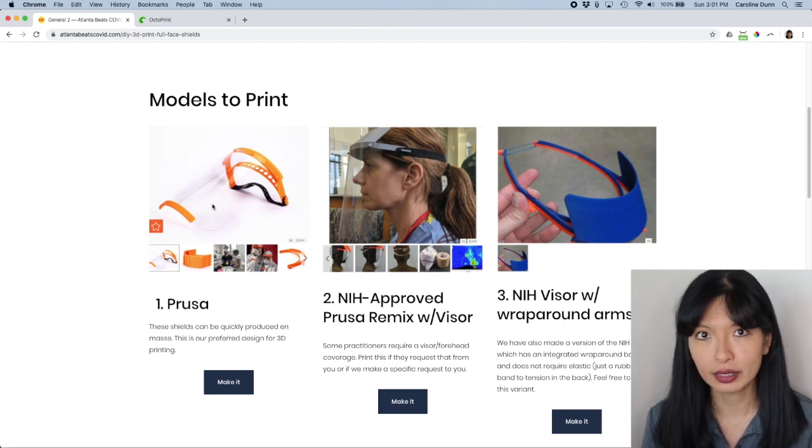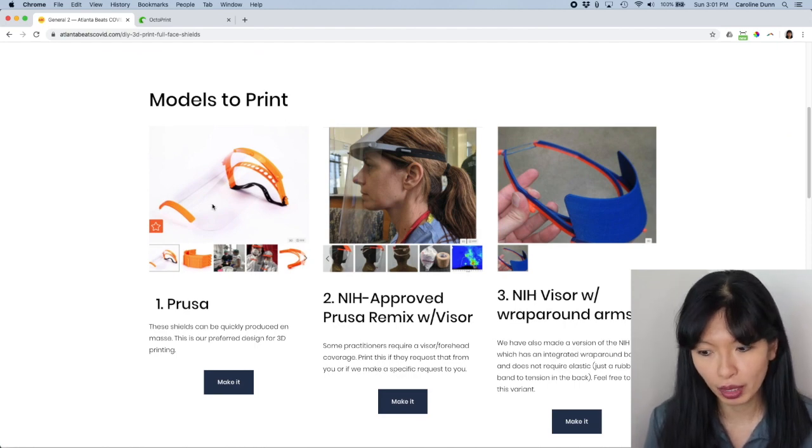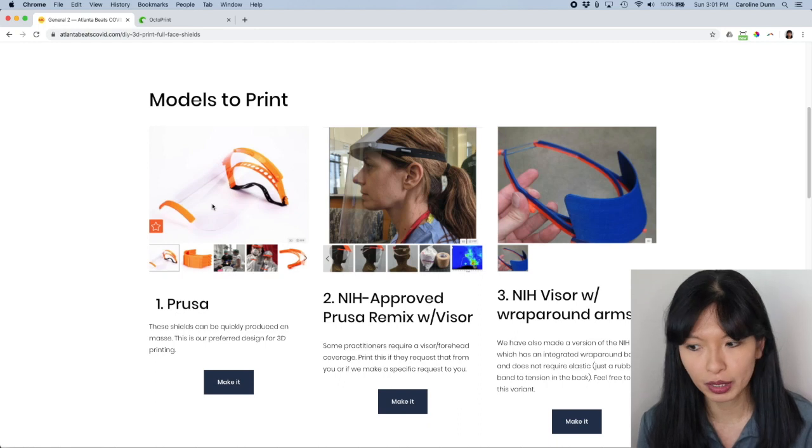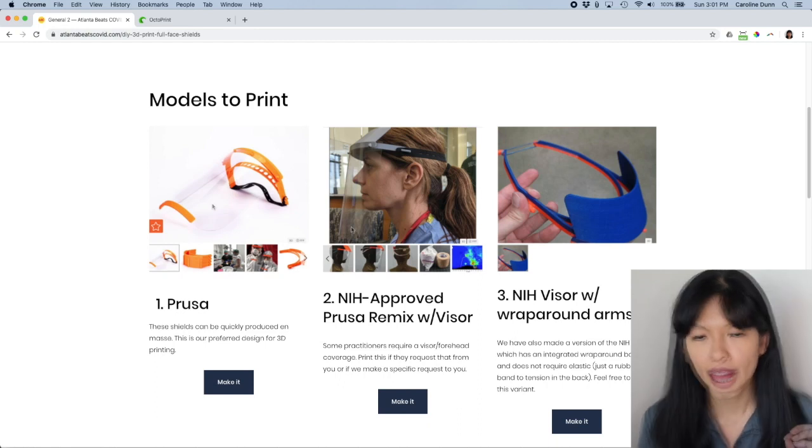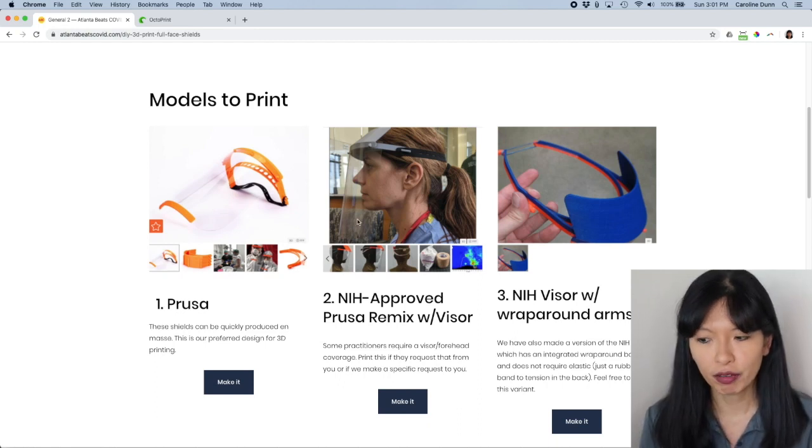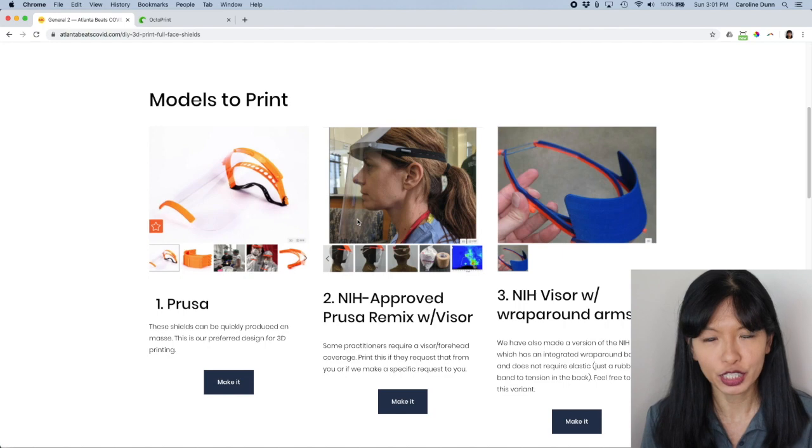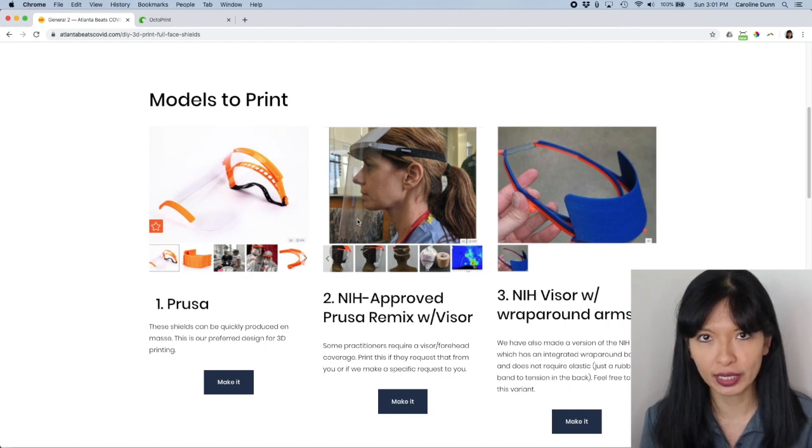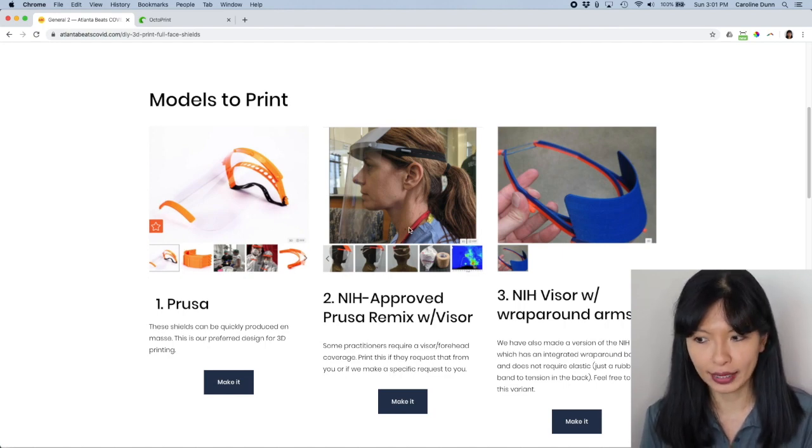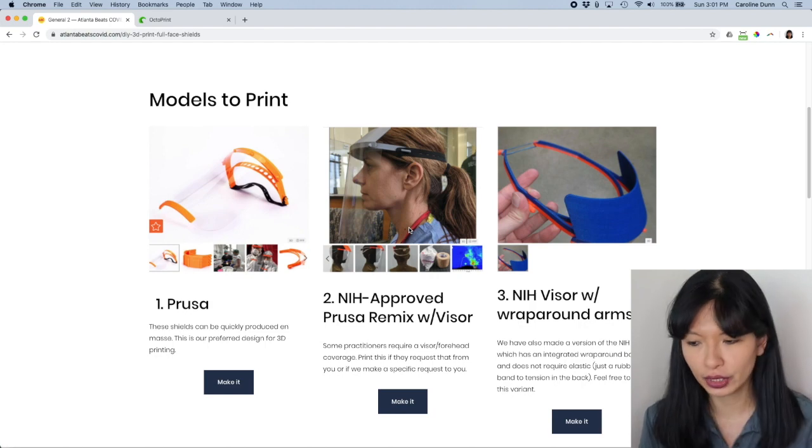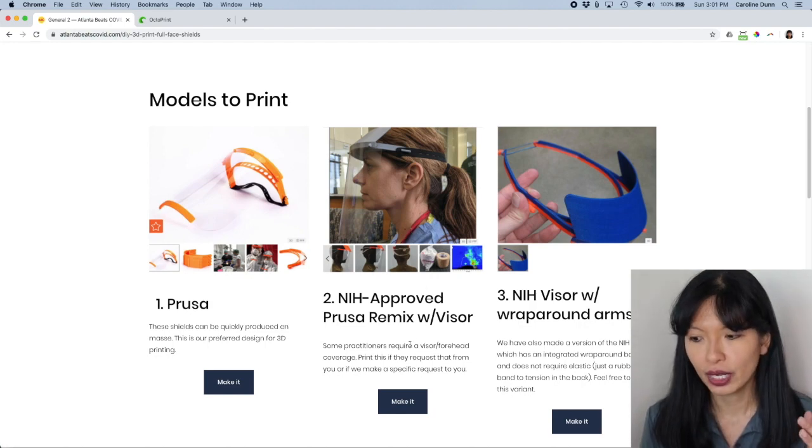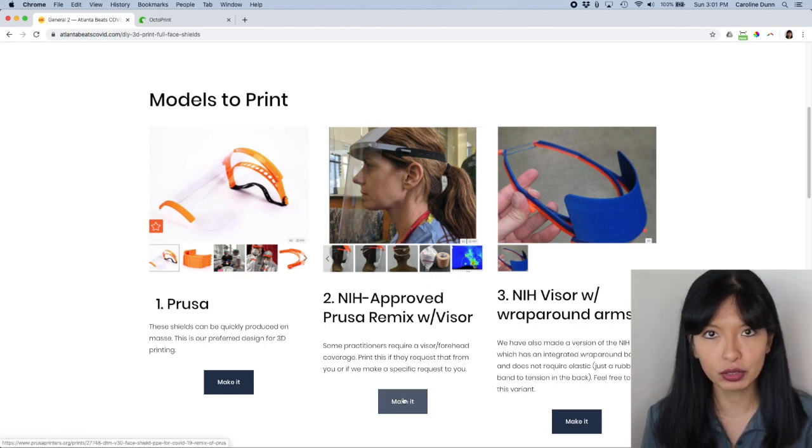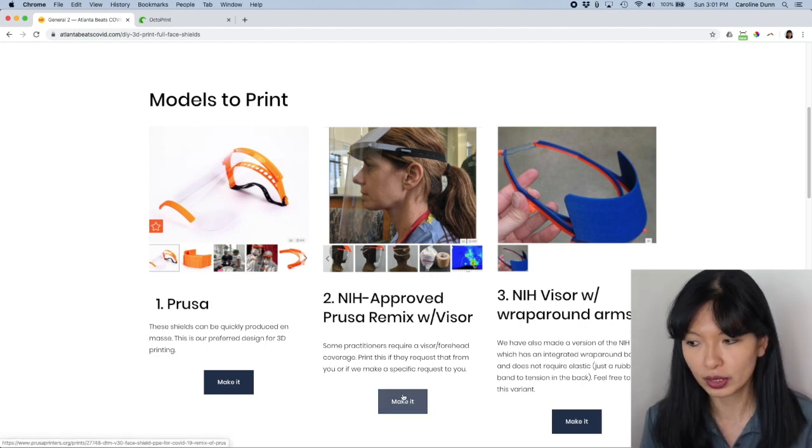And here are the three models that you can print. Now, there is the Prusa model, which is by far the most popular model. If you want to go for an NIH approved model, NIH standing for National Institute of Health, they have a model that has that visor that I just showed you, and you can make that. So those are the two that I've focused on.